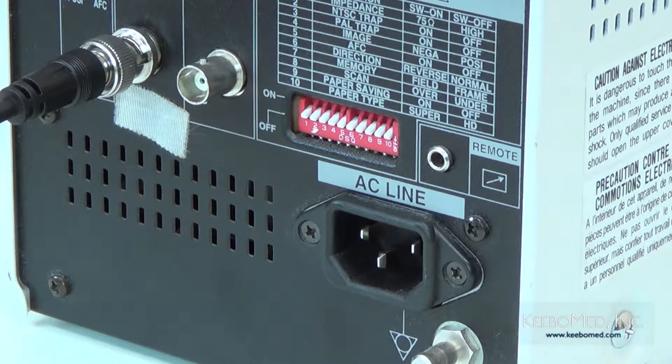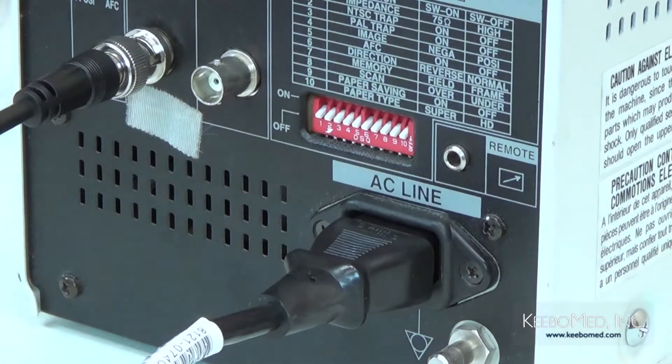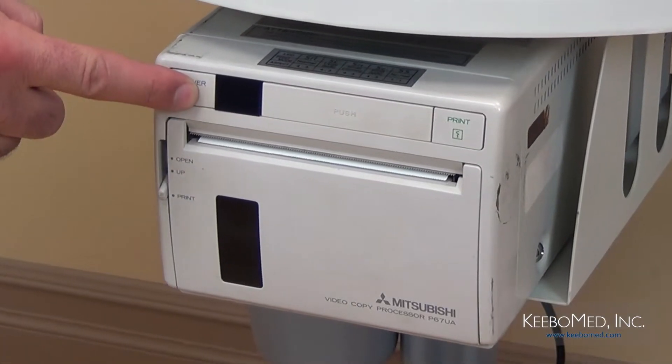Step four: connect the power cord to the rear panel of the video printer. Next, connect the power cord of the video printer to the power socket. Then, turn on the video printer.